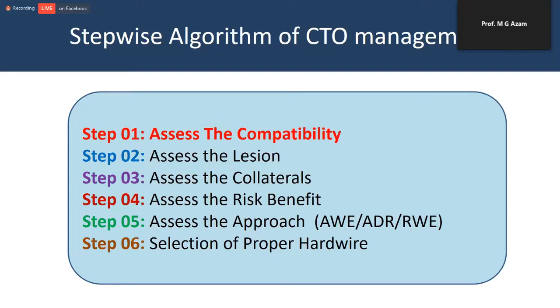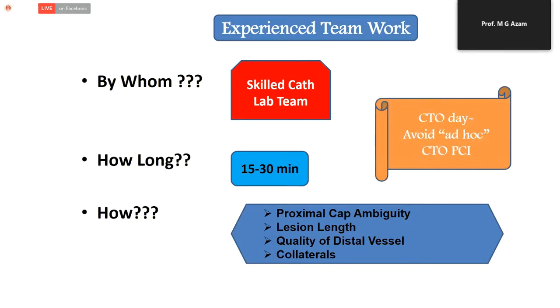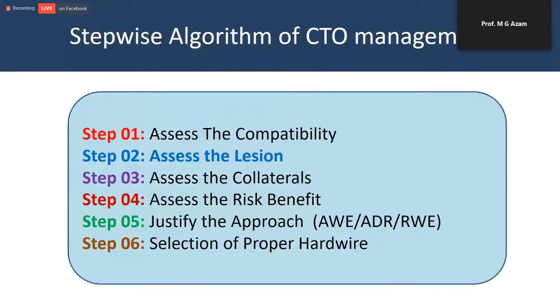If you look at how we assess the feasibility, experienced teamwork is needed, and a skilled cath lab team should evaluate the CTO procedures, and it should be maintained for at least 15 to 30 minutes. How can we evaluate? We should look at proximal cap ambiguity, lesion length, quality of distal vessels and collaterals. Then you should consider it is not on an ad hoc basis. It should be an elective procedure. Then you go on to assess the lesions.